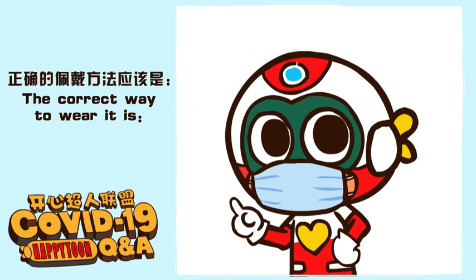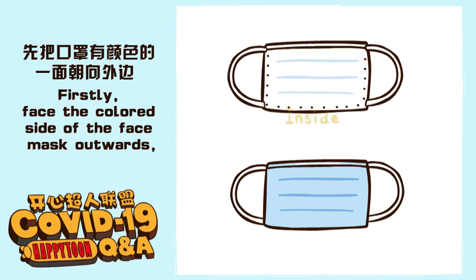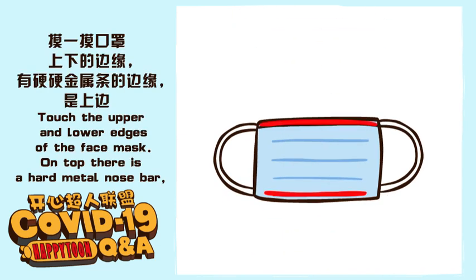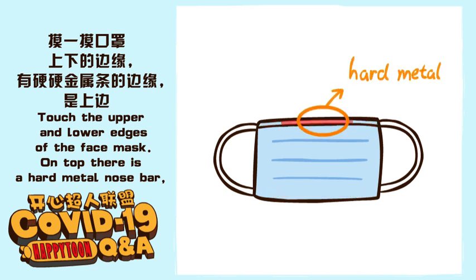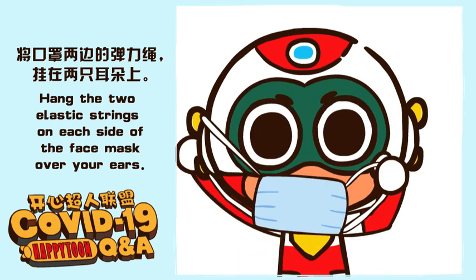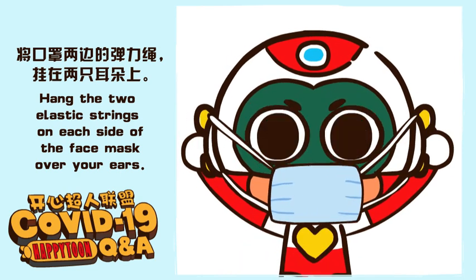The correct way to wear it is this. Firstly, face the colored side of the face mask outwards. Touch the upper and lower edges of the face mask. On top, there is a hard metal nose bar. Hang the two elastic strings on each side of the face mask over your ears.